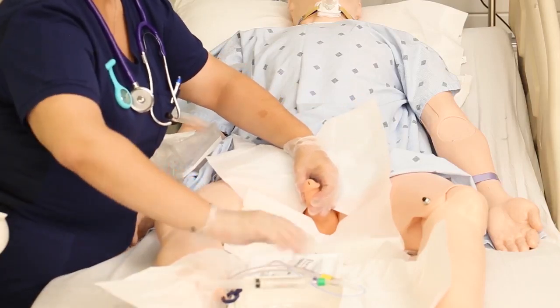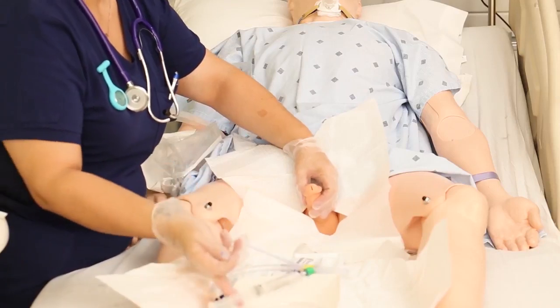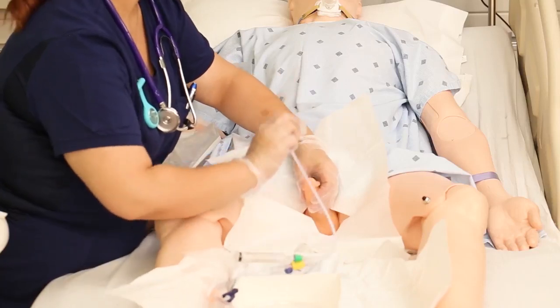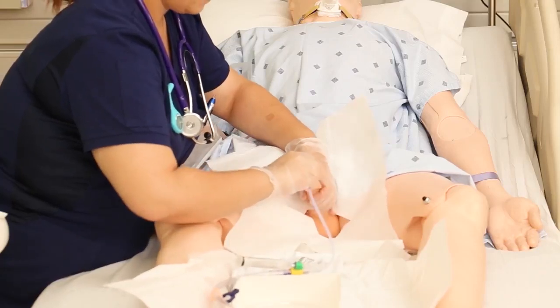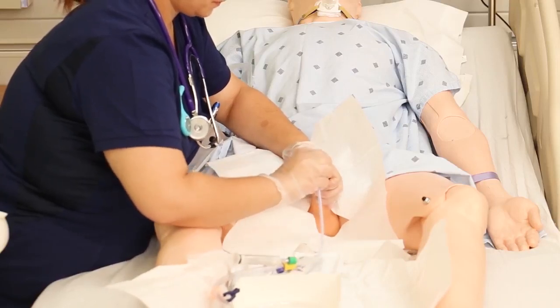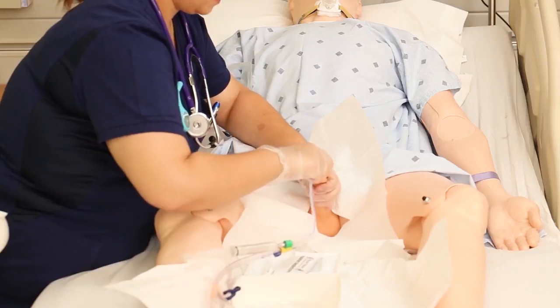Once fully clean, it's time to insert. Don't let go with your non-dominant hand — that hand is now dirty. Carefully pick up your catheter, warn the patient they're going to feel some pressure, and gently insert it into the meatus. Typically, advance until you see a flash of urine in the tube. In males, going all the way to the hub is usually appropriate.